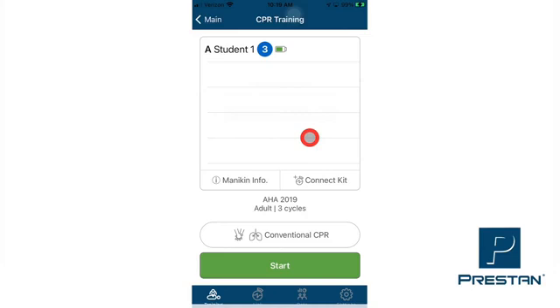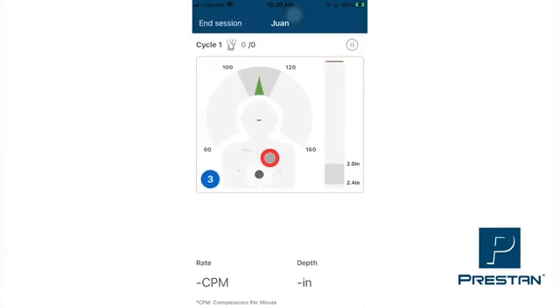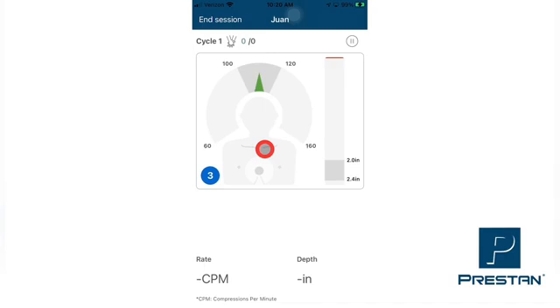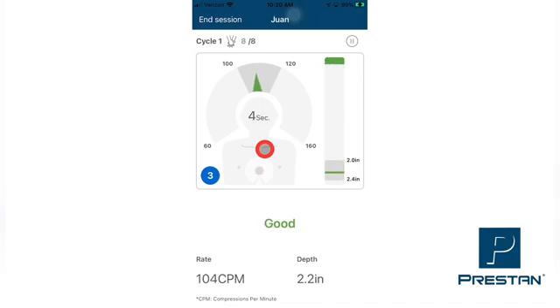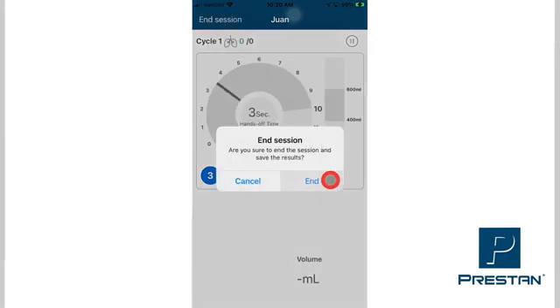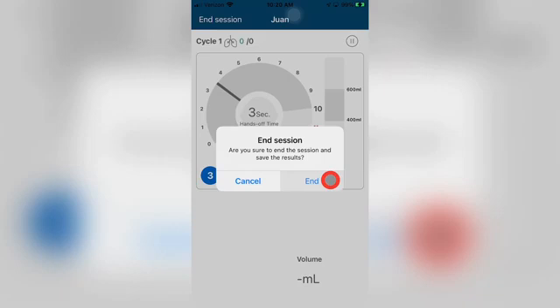Once all mannequins have been renamed, your training session can proceed. Please be aware that this new name is only a temporary name assigned during this training session. This new name will appear as the mannequin name and will also show on the data list and any reports that are generated. To clear the name from the mannequin, close the Preston CPR Feedback App or restart this process for renaming the mannequin.